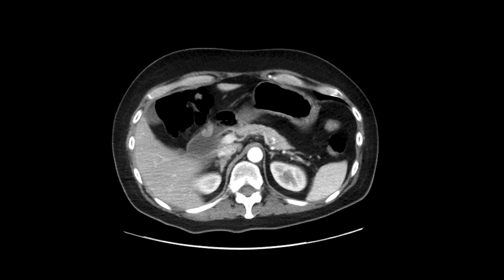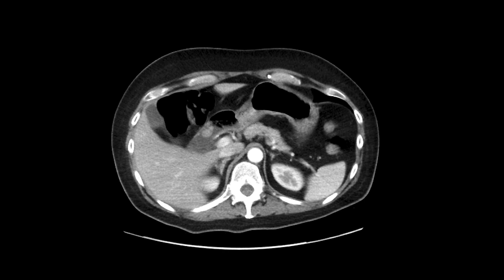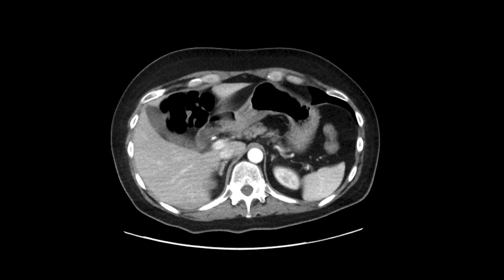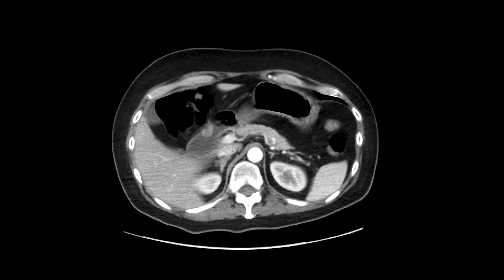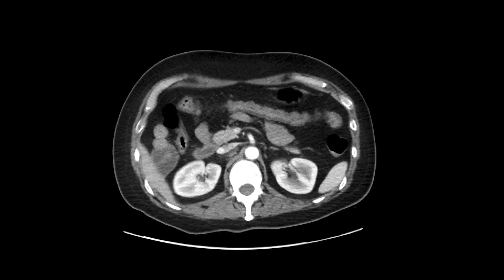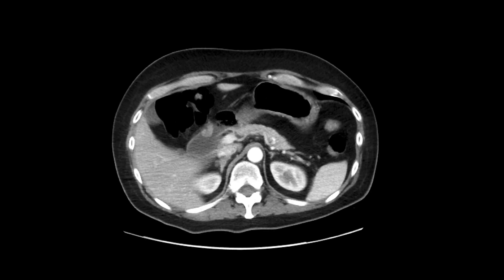This is a common location in the gastric antrum and proximal duodenum. Sometimes you can see a central umbilication inside of it indicating the pancreatic duct. This had been stable for a number of years and had a very good look for it being heterotopic or ectopic pancreatic tissue.